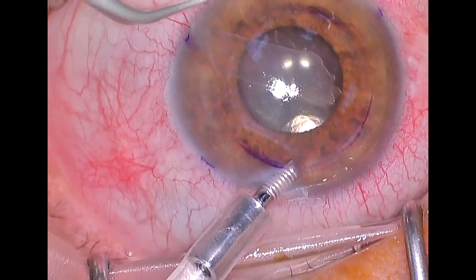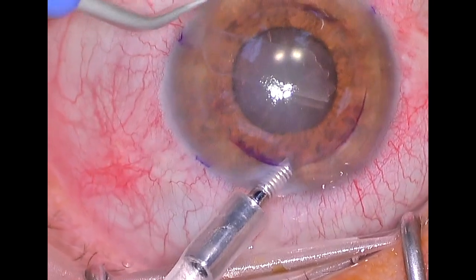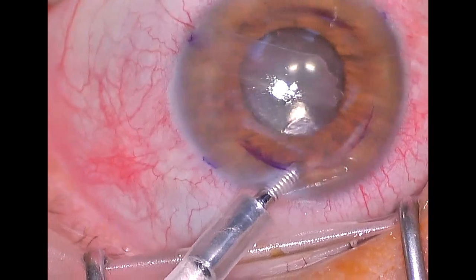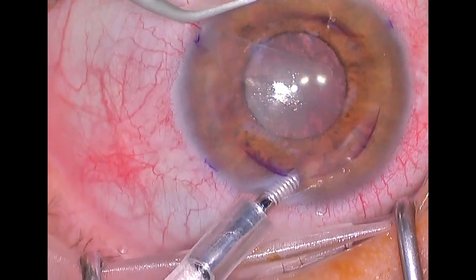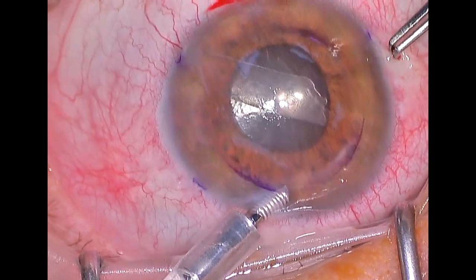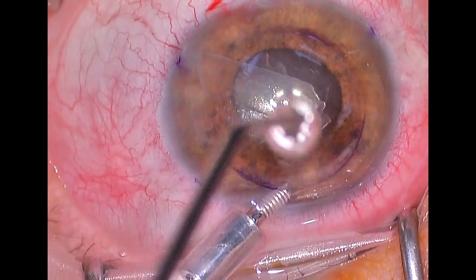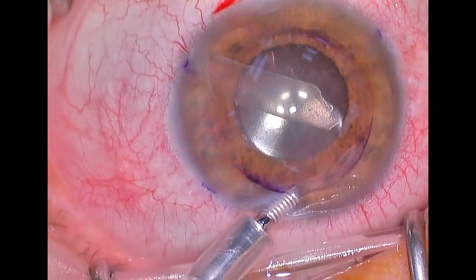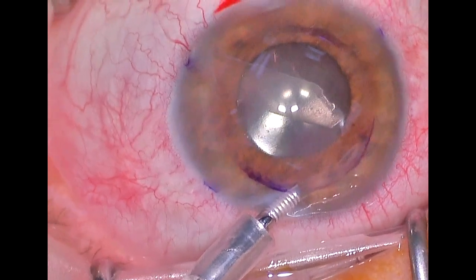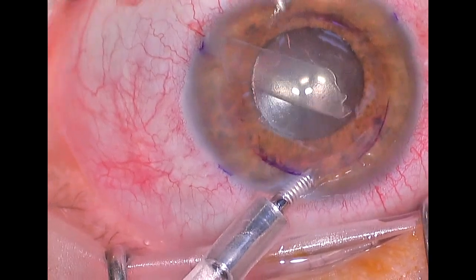When we place the new tissue, you'll see it behaves similarly — it's in a scroll, although the scroll for the healthier tissue tends to be a much tighter, smaller scroll. We then begin our main incision into the anterior chamber. That's a three millimeter keratome incision, and we use that incision to remove the scroll of endothelium from inside the eye.